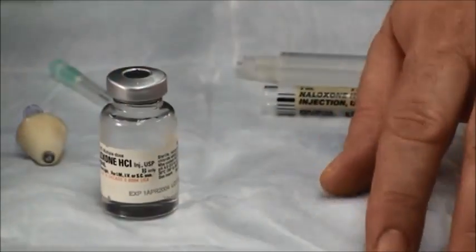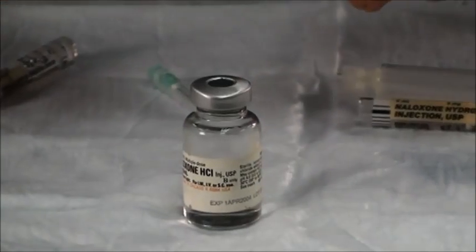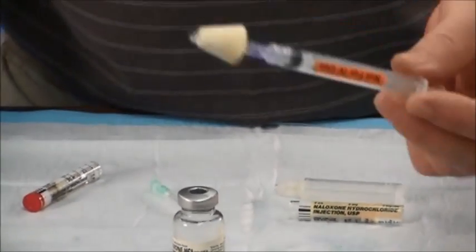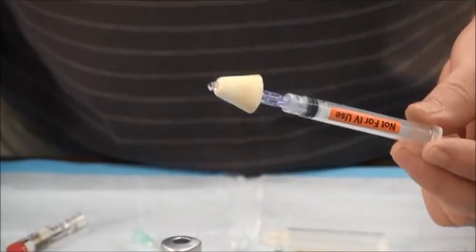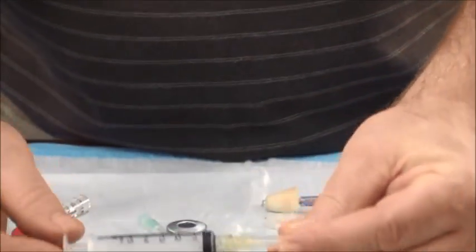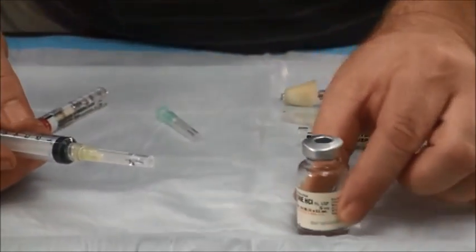Let's first start by doing the multi-use vial. Typically the nasal atomizer comes with a three milliliter syringe. If you wanted to draw up more, you'll just have to change out the syringe. Here's a five milliliter syringe with a multi-use vial.